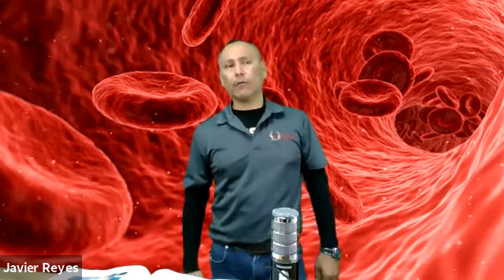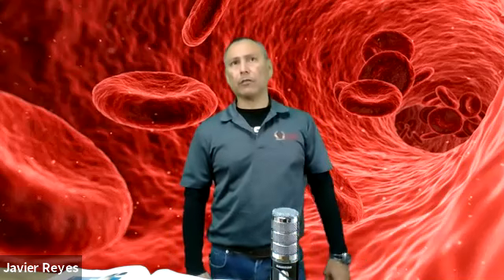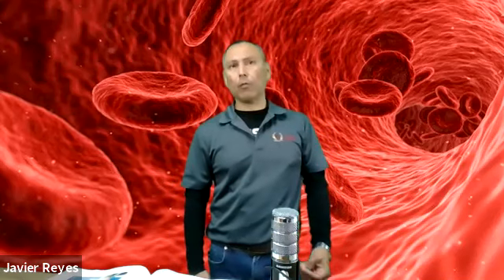The patient has clot-forming tendencies. Many times we will perform punctures on patients that clot very quickly. The blood will stop flowing right away, and this may be a reason why you can collect a capillary puncture. The patient is very, very afraid of needles. Not that lancets are not needles, but they can't see it, so that may help them cope with that procedure. So that's another reason.